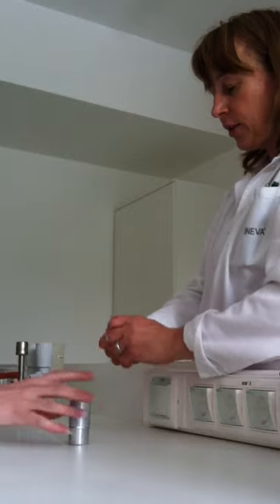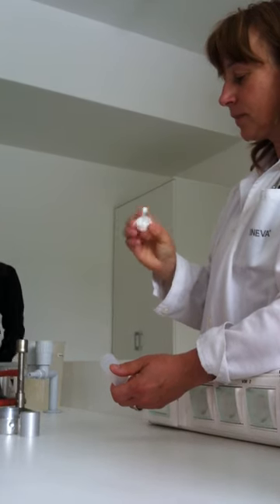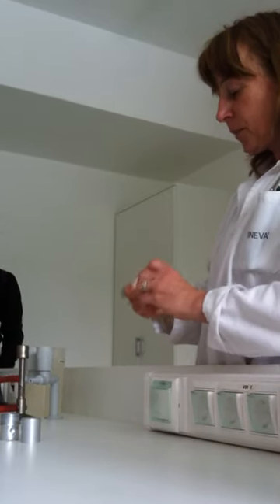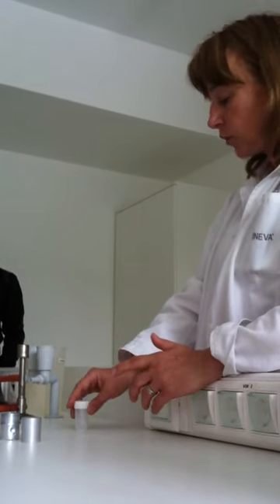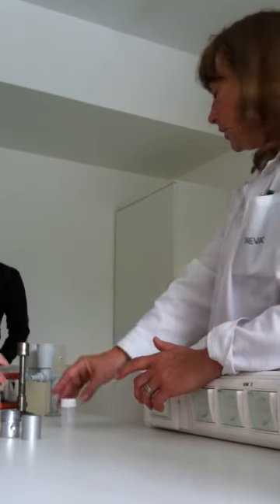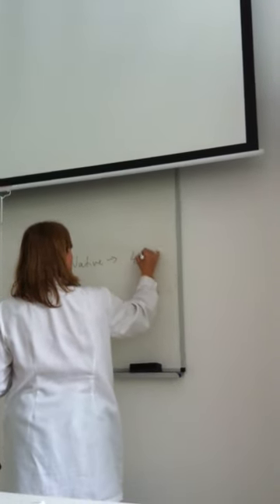Normally, we use this one. So if you can transport within 2 hours, fine. If not, you should keep it at 4 degrees. So a native sample you should usually keep at 4 degrees. If native. There are exceptions, but now the stool also.